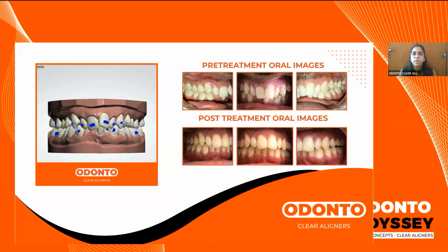So, which is why we do not want to rush into the process to reduce the number of sets, because sometimes we have to be a little patient and allow movements posteriorly and movements anteriorly to happen in isolation, and not just try to run after reducing the number of sets, to ensure that we receive a good favorable result in terms of relieving the crowding, closing the spaces.